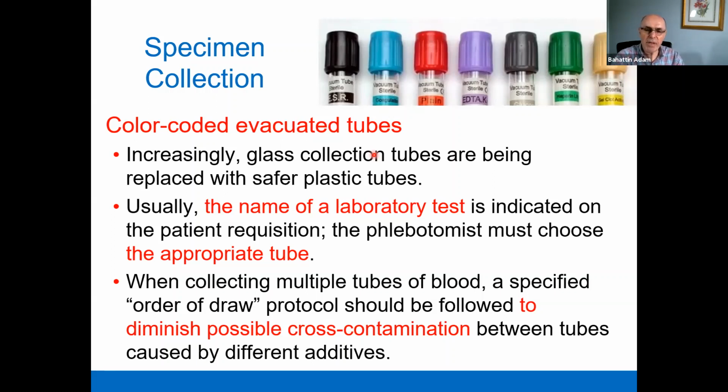Sometimes you are going to collect blood in a few test tubes, and the order of the tubes is also important in order to diminish possible cross-contamination between tubes caused by different additives or anticoagulants.